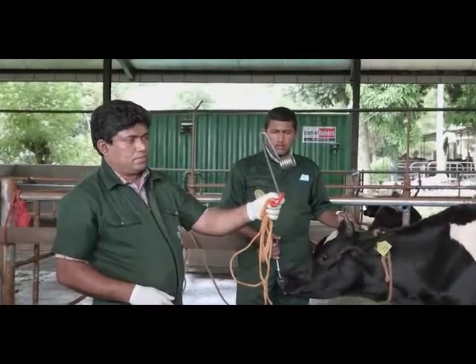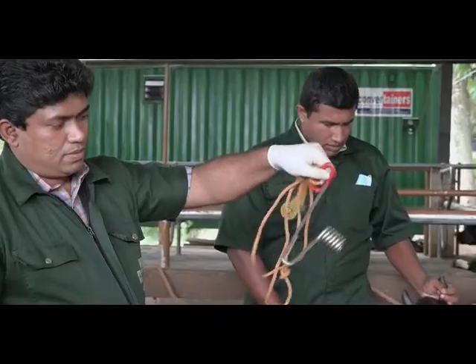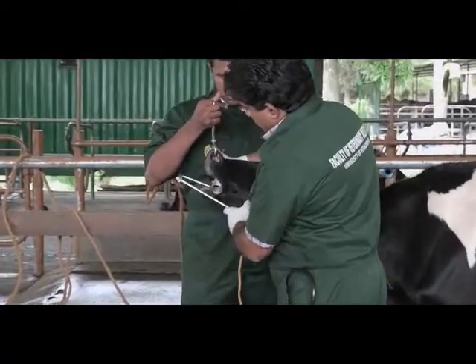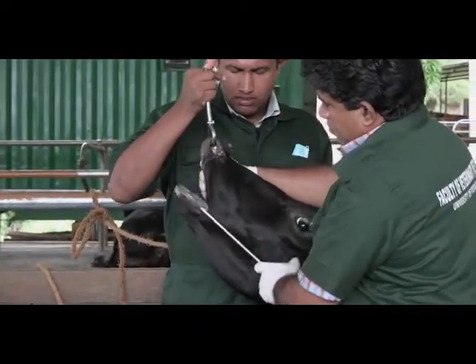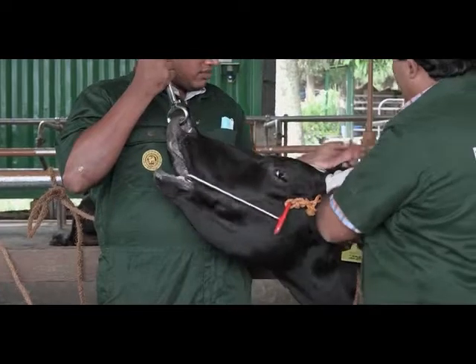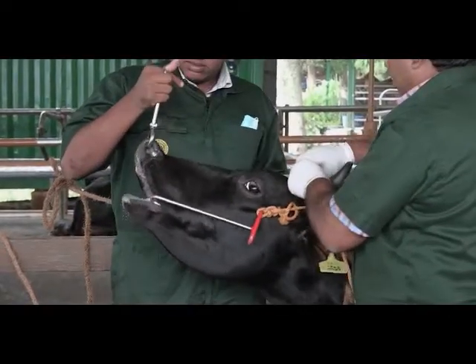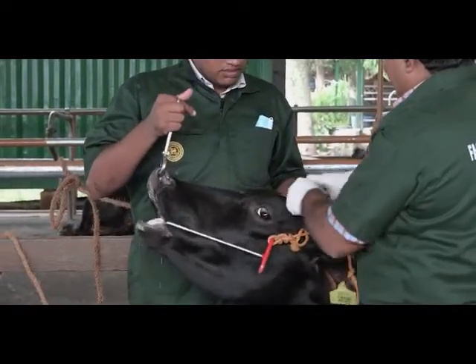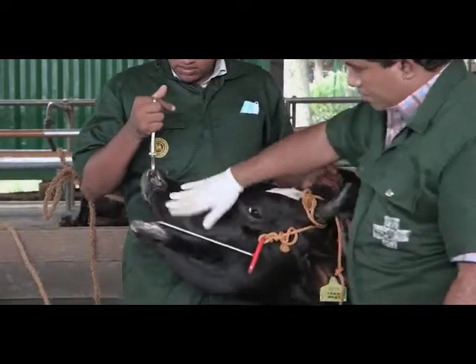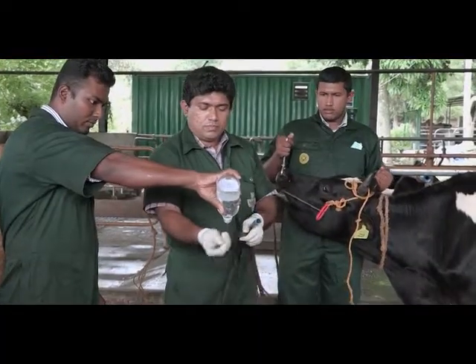Before inserting the stomach tube, we need to place a mouth gag between the jaws as demonstrated. This will prevent biting of the tube by the animal. The mouth gag can be secured to the horns, the neck belt, or someone can keep it in place. Next, lubricate the stomach tube with liquid paraffin or a suitable lubricant.